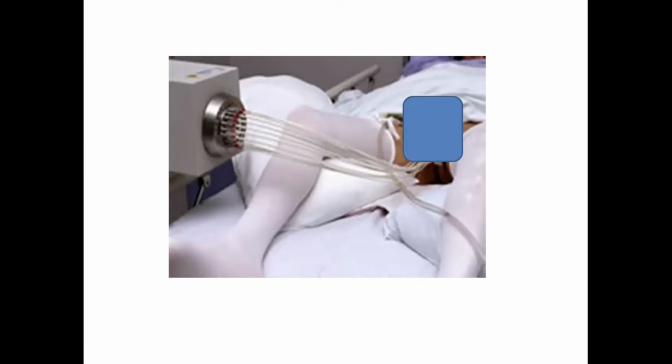To deliver the dose of radiation deliberately straight into the prostate gland, but not into the bladder or the back passage or anything else. And therefore you're avoiding an awful lot of normal structures by doing it this way.